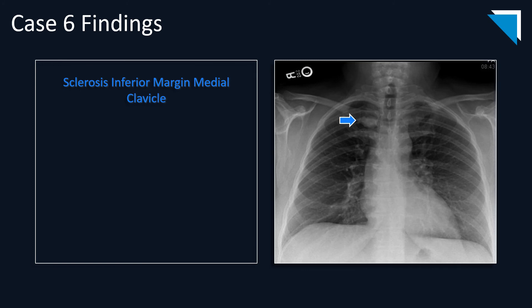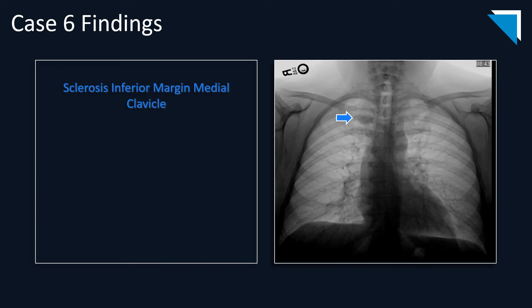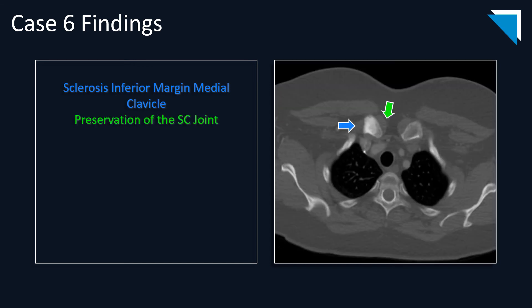The last case is a 45-year-old female presenting with right-sided sternoclavicular joint pain. On the radiograph, there is sclerosis along the inferior margin of the clavicular head. On an inverted radiograph, you can see sclerosis within the inferior margin of the right clavicular head. On axial CT, there is sclerosis along the inferior margin of the right clavicular head with notable preservation of the sternoclavicular joint.